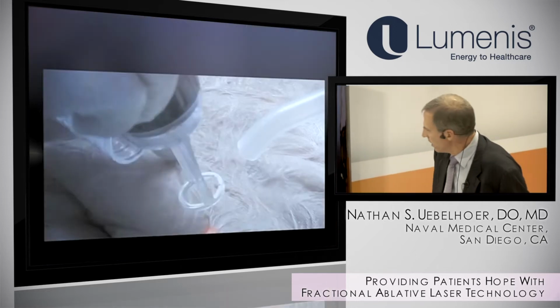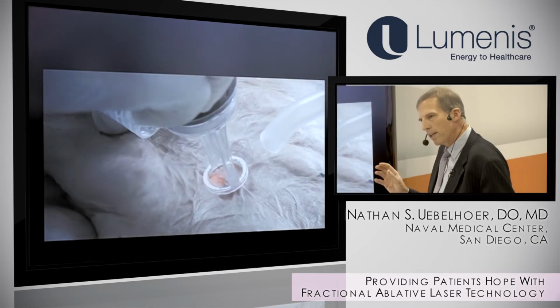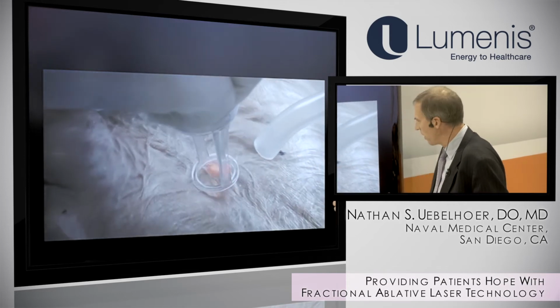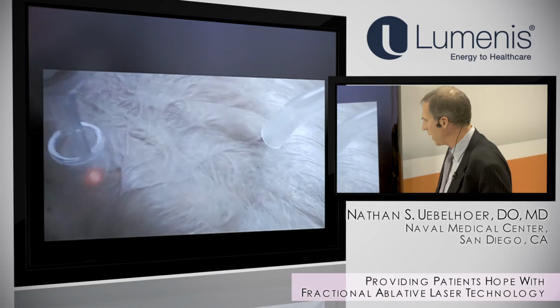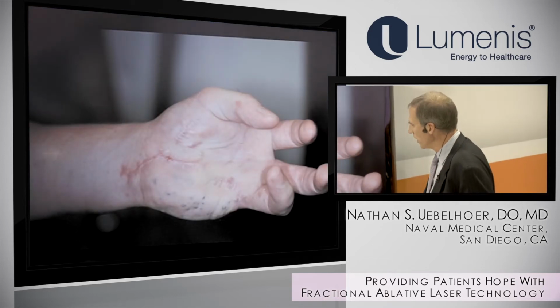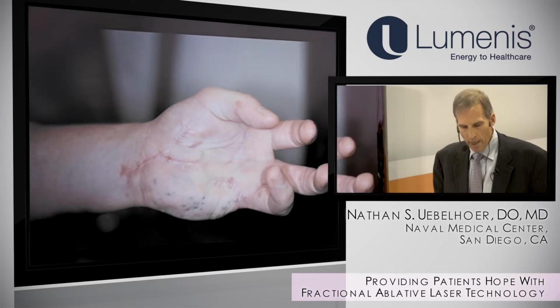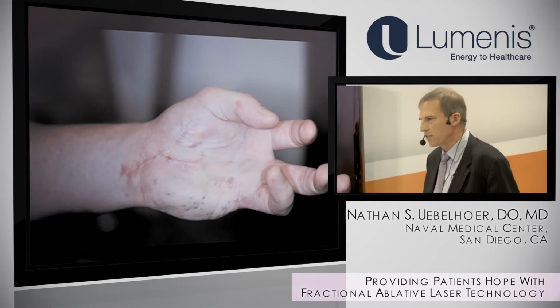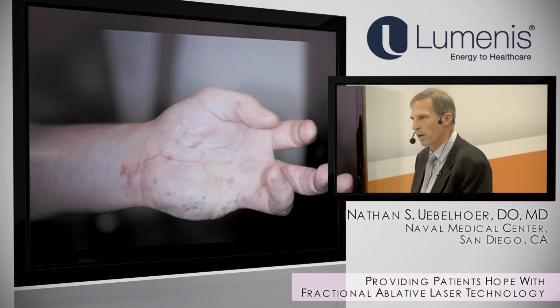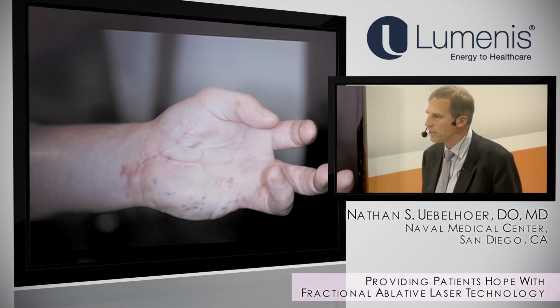So here's the procedure in action. You can see the stamping technique. Stamping a handpiece is so critical when we're moving around through these scars. It's very difficult to do it with a different type of handpiece. And you take this patient, one of our early patients, who had a blast injury to his hand, lost one of his fingers, had 14 surgeries, and was about to have another surgery to try and release his hand some more. Here he's trying to create a fist with his hand as hard as he can, and you can see the blanching in the skin.